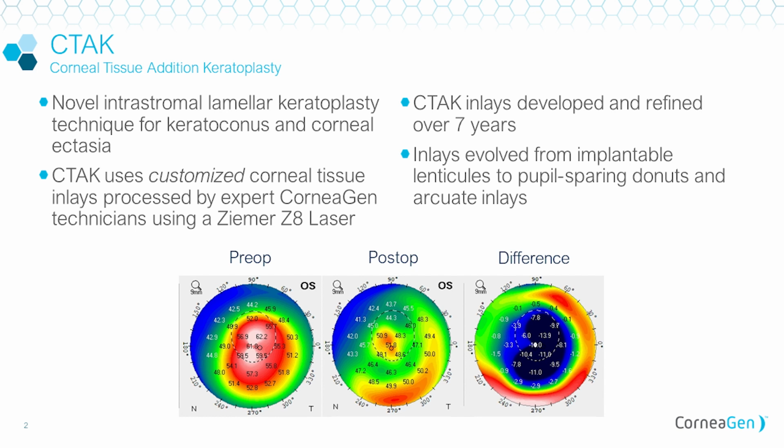It's about 30 years now. And this is the one thing that I've seen surgically that really has a wow factor for the patients. So many of the patients get this done, and they're seeing so much better in addition to having their topography improved. You can see it on the screen there that the inlays, I'll show you how CorneaGen processes them in just a moment, are clear and well tolerated. They've been tolerated in our practice and in our clinical trials for several years now.